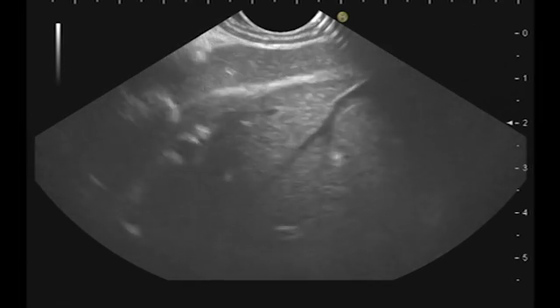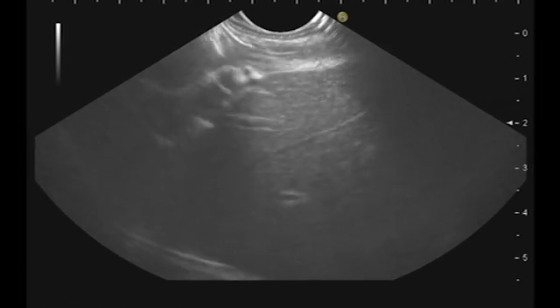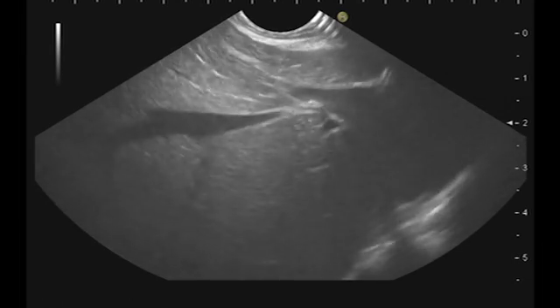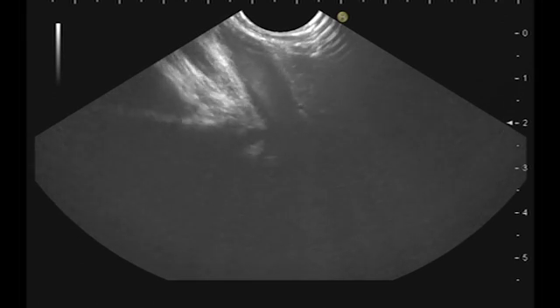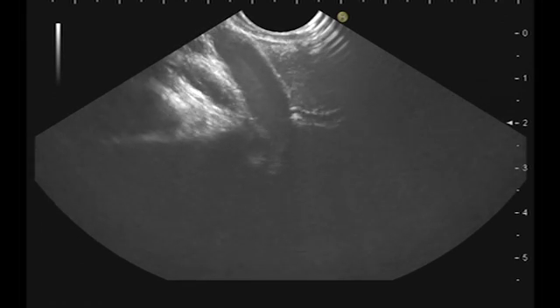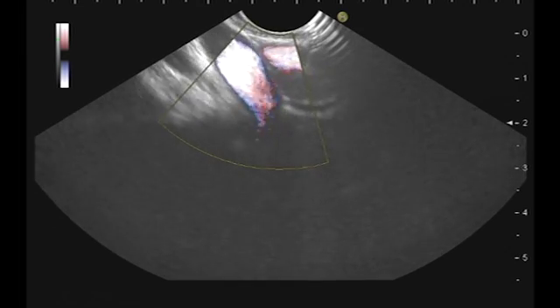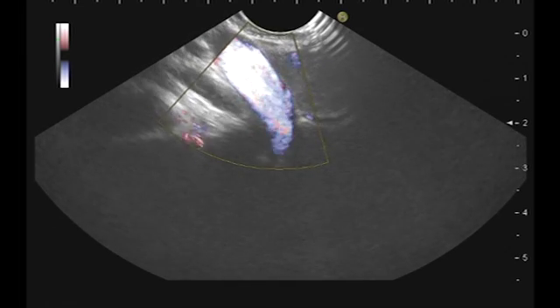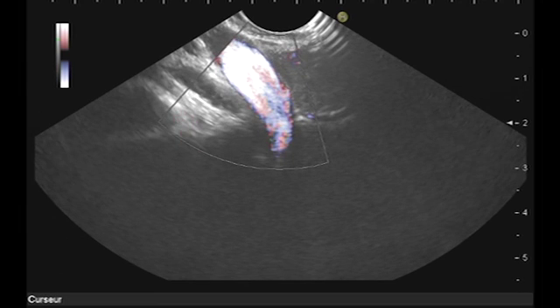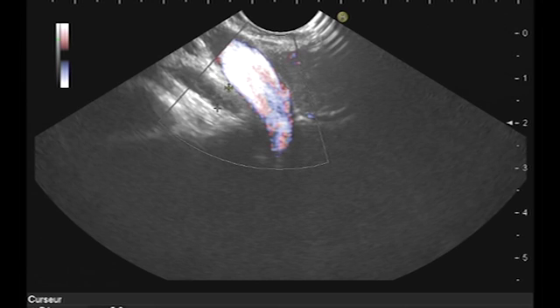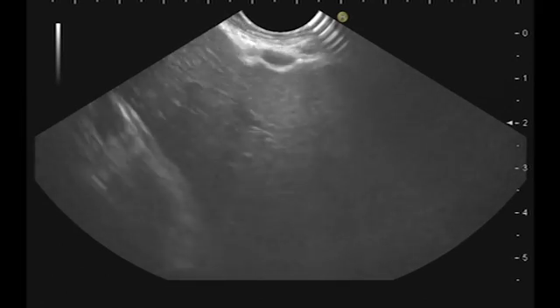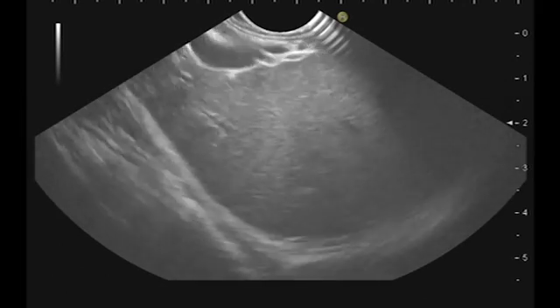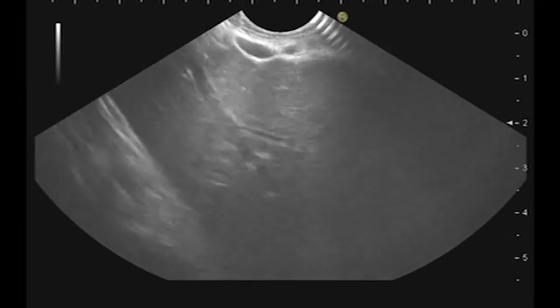Now I introduce the scope. The scope is in the stomach. Here we have the left lobe of the liver. And this is the portal vein here. We have also the CBD just here, which is not dilated — five millimeters. This is the left lobe. There is no dilatation of the duct.